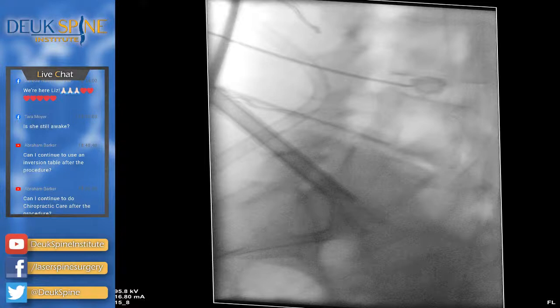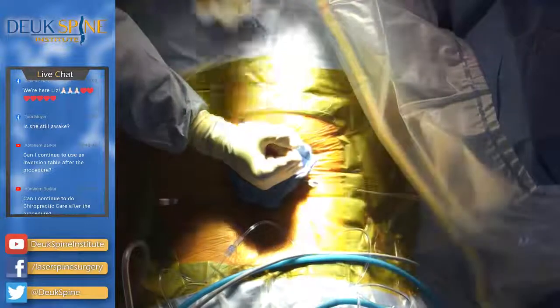Let's go lateral, please. Pressure. So we got lucky with L5S1. Let's see if we can get lucky with L4-5. Go ahead. So what I mean by that is we're able to get in and get it done. A lot of times when it's bone on bone, there's not much disc space. We're taking a space that's maybe 3 millimeters and opening it now to 7.